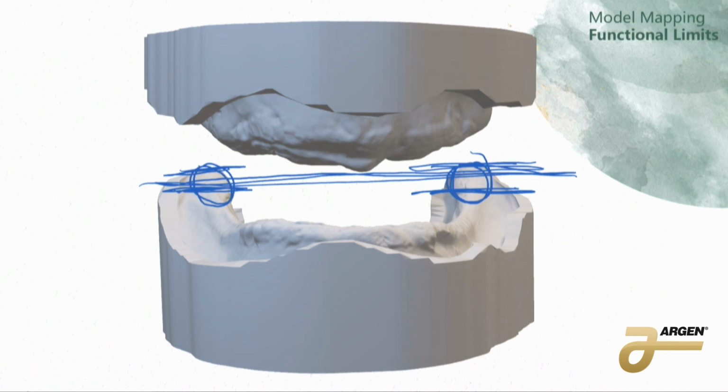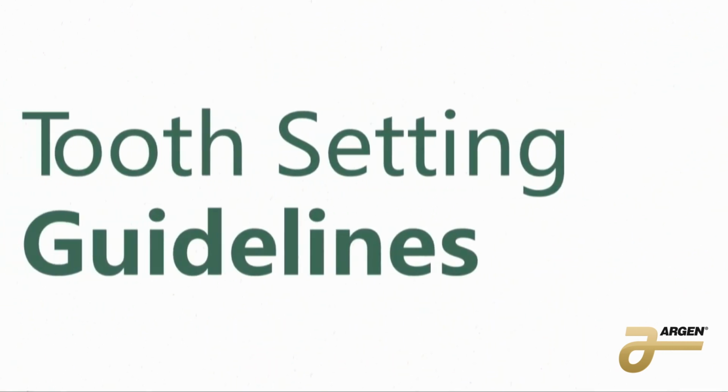So like I said, I'm not going to go too much into tooth setup. This is a whole other world that we could dive deep into for hours and hours. I highly suggest, if you are new to dentures, do some investigating into a lingualized posterior setup. I really like a lingualized posterior setup. What that means is your lower posterior teeth are a little bit flatter, like a lower degree of teeth. They don't have a lot of cusps. And on your upper teeth, only the lingual cusps are touching. So that force is always going to be driven down, and you're going to have freedom in movement.